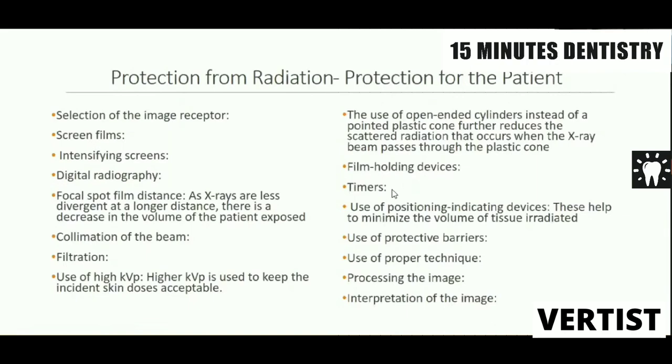Previously, we used to get conventional timers, spring control timers, and the timing for exposure was in minutes. Now we have 0.5 seconds. Okay, those are the electronic timers. Positioning of indicating devices, use of protective barriers, use of a proper technique, processing of the image should be proper and interpretation.